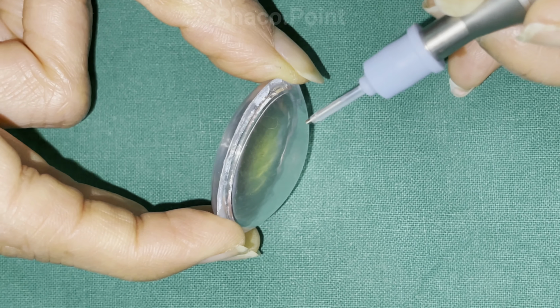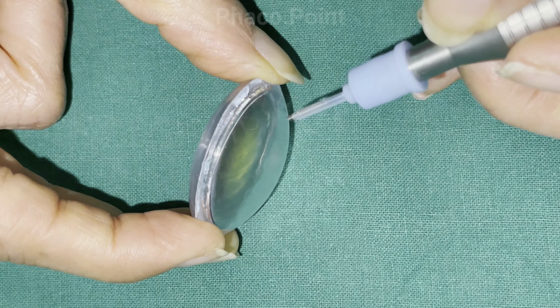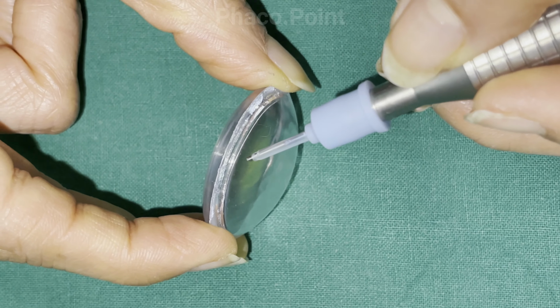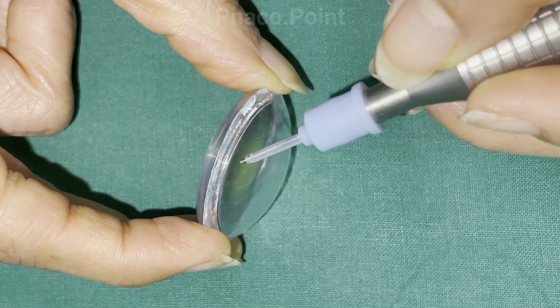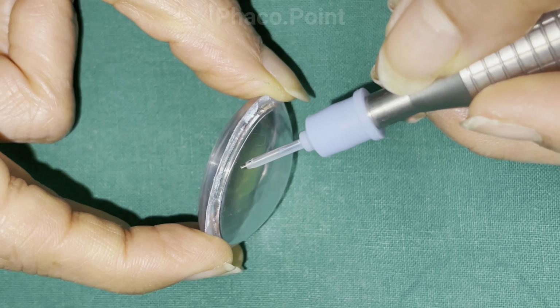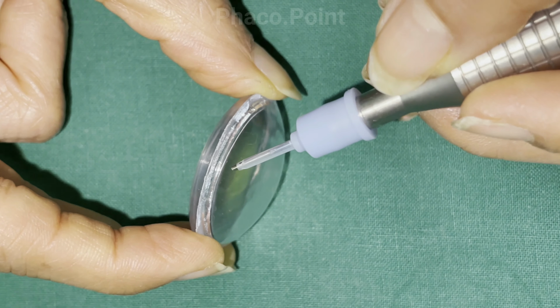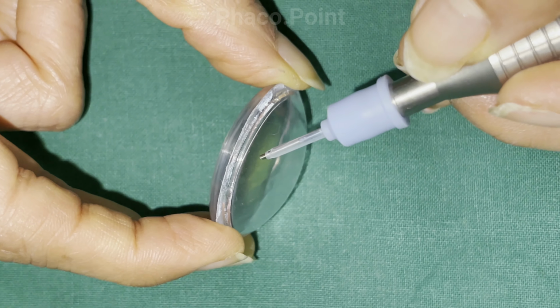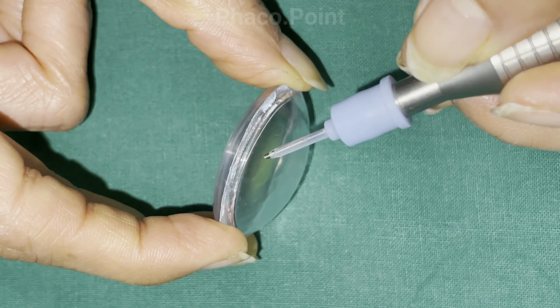However, if they started chopping proximally and went in a downward direction to impale the nucleus, you're likely to get down to the depth of the nucleus in its thickest part in the center before performing the chop, that is the lateral separation with the second instrument.